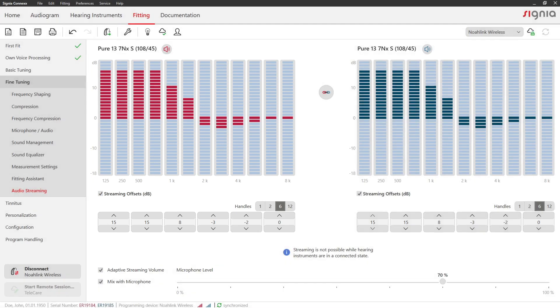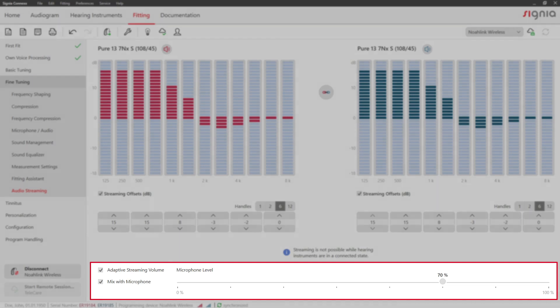In this example, the client will receive more gain in the lower frequencies during streaming and less gain in the higher frequencies. This setting is optimized for listening to music. Adjust streaming settings like the microphone level below.